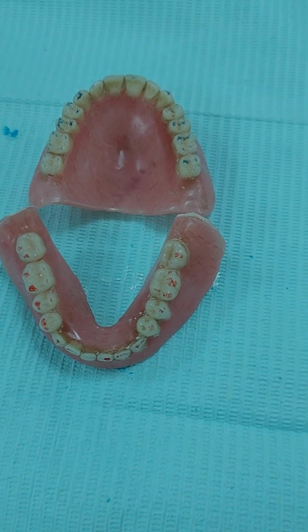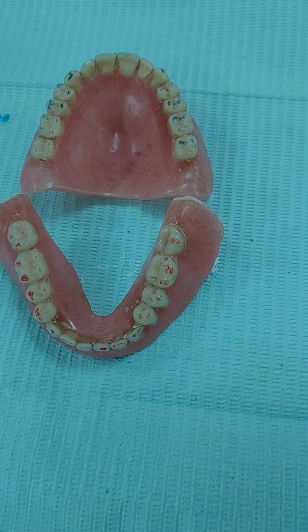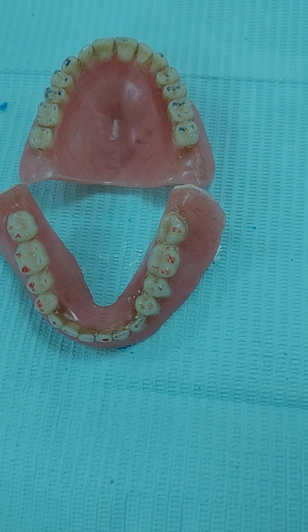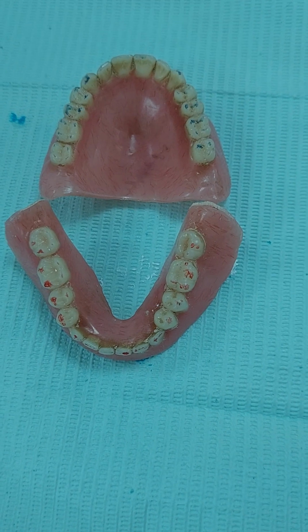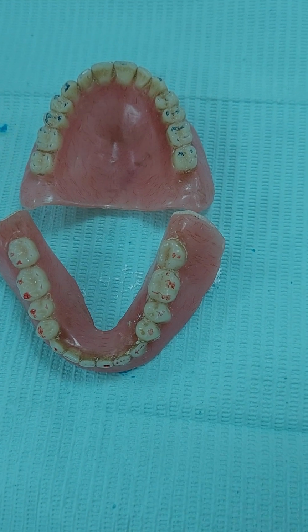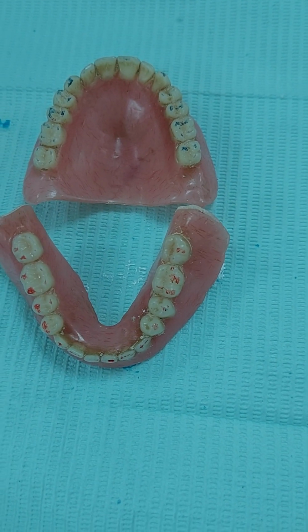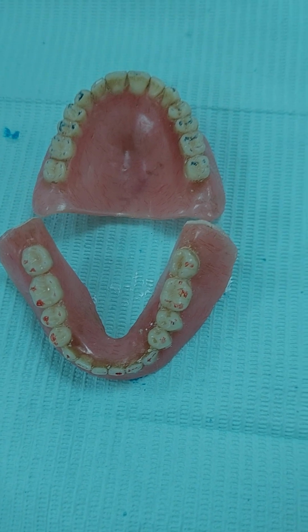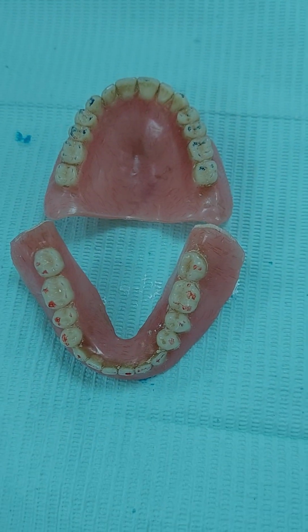Once you finish all your adjustments, remove the old colors, wipe everything away with an alcohol swab, and then repeat the excursive movements. Here in excursions, we don't touch functional cusps because they are already establishing the bite that was done in centric. This is why in eccentric we work on non-functional cusps, and in protrusive on the lower anterior.